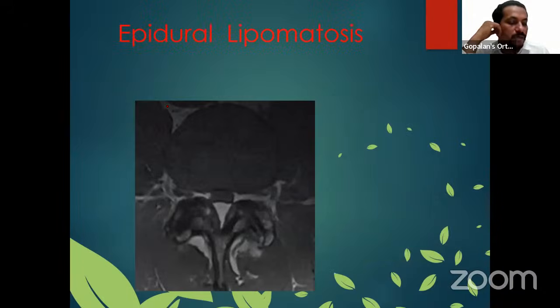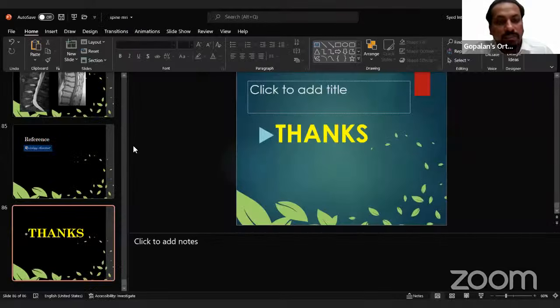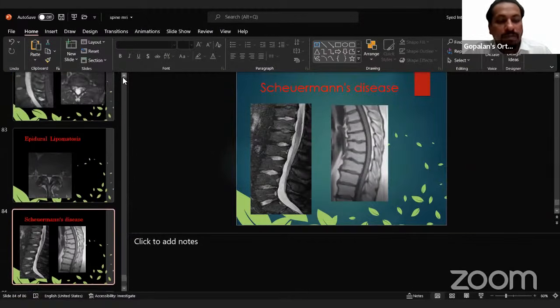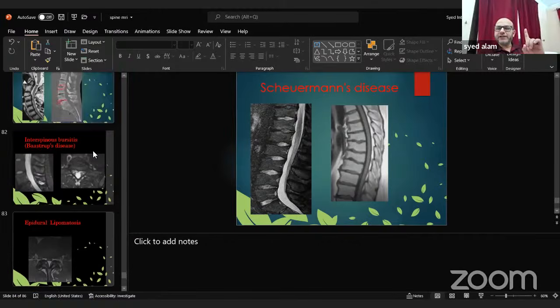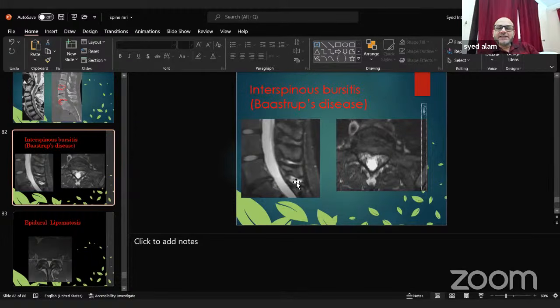Okay, and one more question by Dr. Pratipati Rambabu: how to decide which disc bulge is causing symptoms if there are multiple disc bulges? Let me finish. We have 3 slides. Okay, fine, great. We have 3 slides and then we could take questions. This is also very important. Keep it full screen.